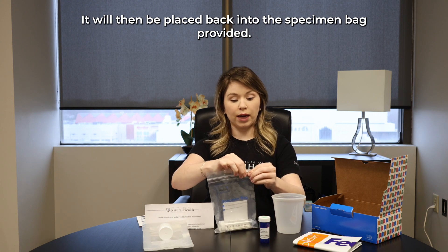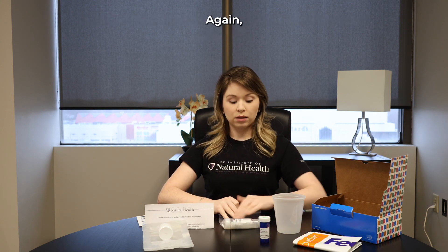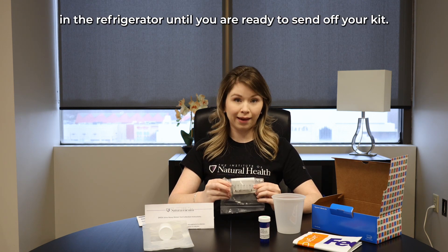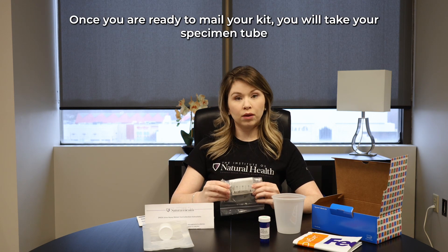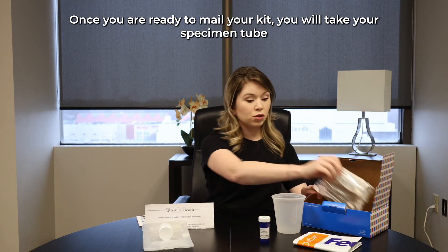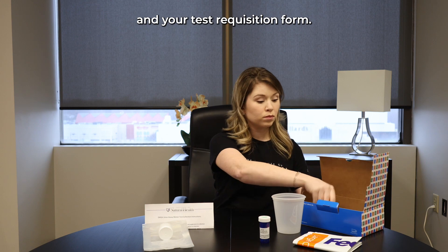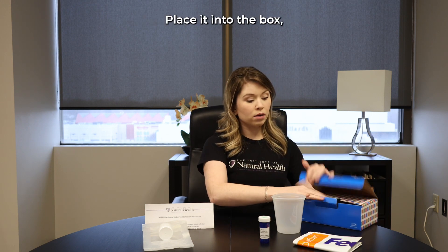Push the cap back on and make sure it is nice and snug, then you want to fill out any important information on that tube. It will then be placed back into the specimen bag provided. You will want to store this sample in the refrigerator until you are ready to send off your kit.